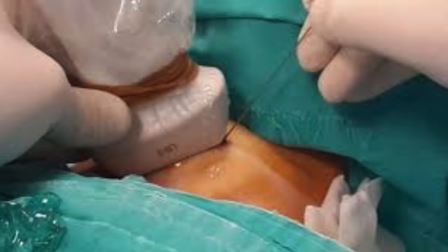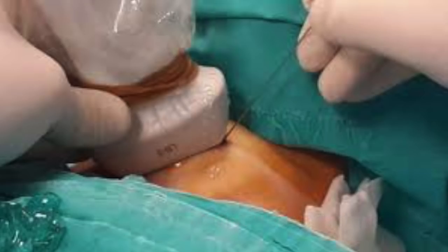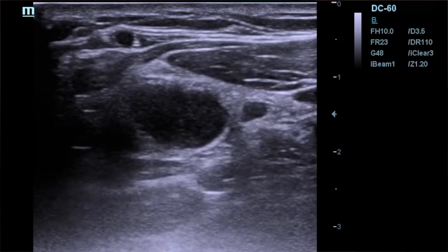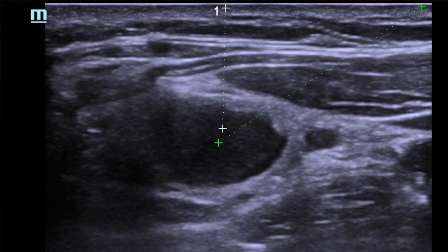For deeper tissues especially in abdominal cases, I generally prefer a spinal 23 needle after withdrawing the stilet. One good habit before starting is to scan the patient thoroughly to localize the lesion and its distance from the skin surface where the needle will enter.